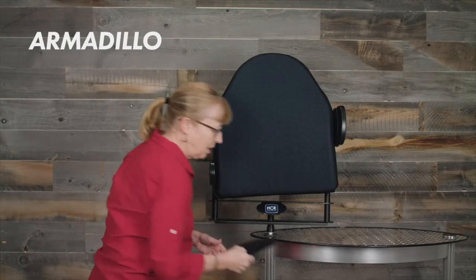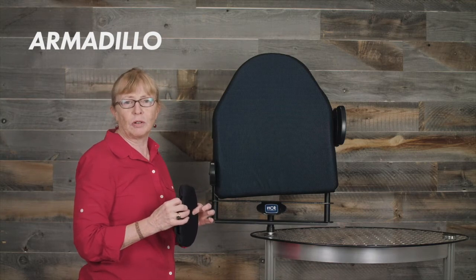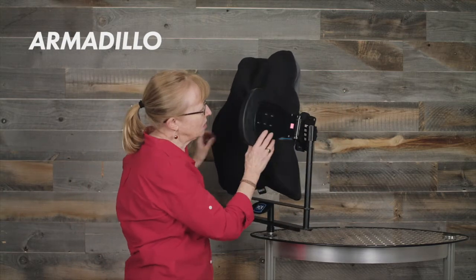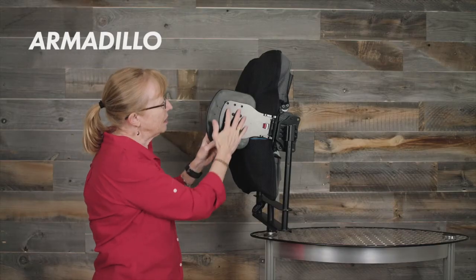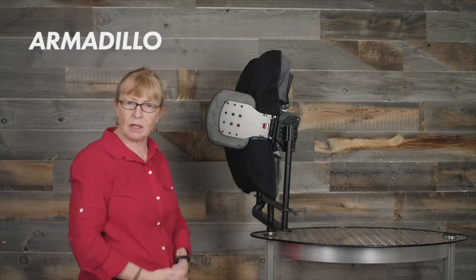All of our pads can also come with a neoprene cover for extra comfort for the client. We also have a fixed deep lateral with an extra large pad, or a swing away lateral with an extra large pad. Here is the swing away, which allows you to move it — for a transfer, for example. The pad itself being extra large, you do have the flexibility of moving it up and down.